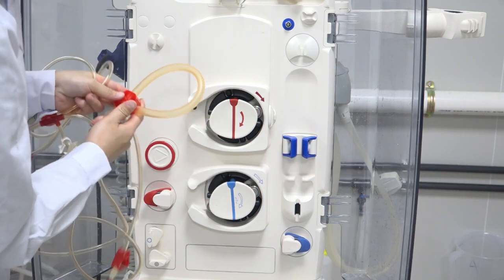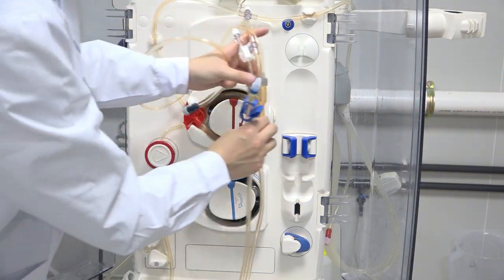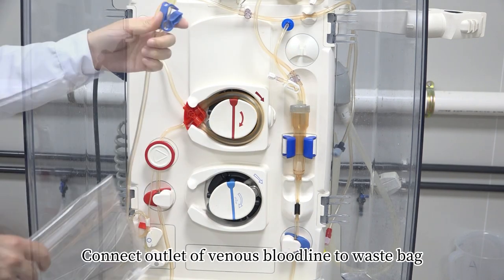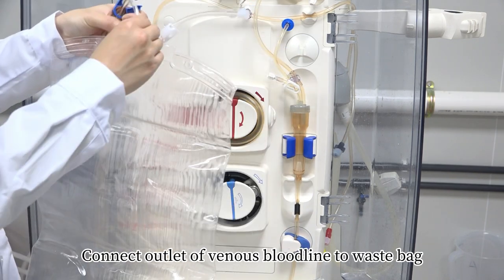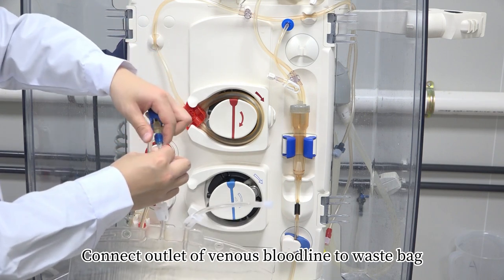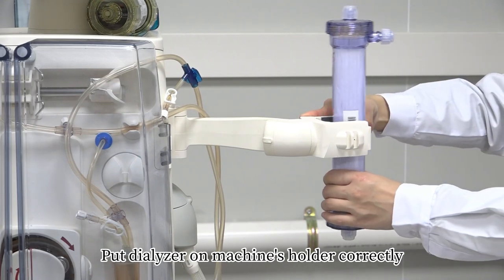Step 1 – Install Tube: Install arterial bloodline correctly. Install venous bloodline correctly. Connect the outlet of venous bloodline to the waste bag. Put dialyzer on machine's holder correctly.